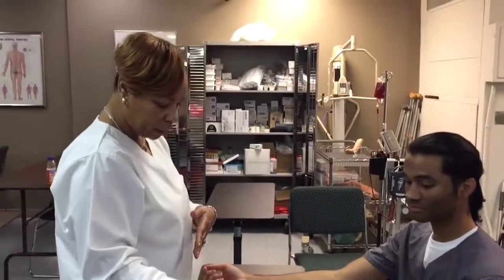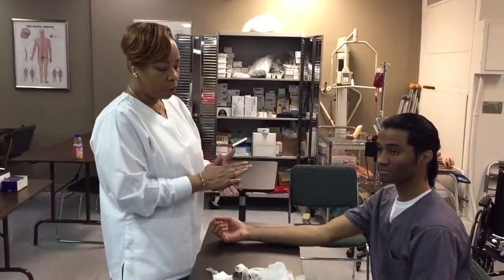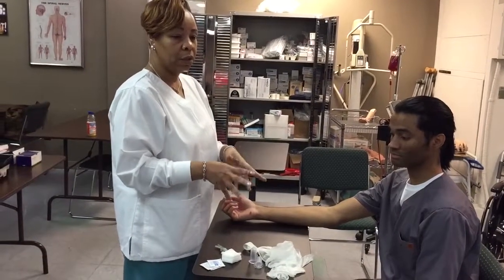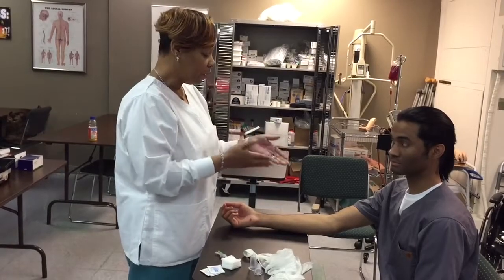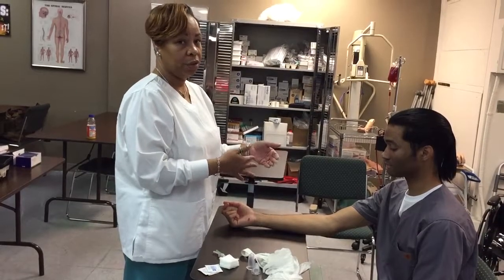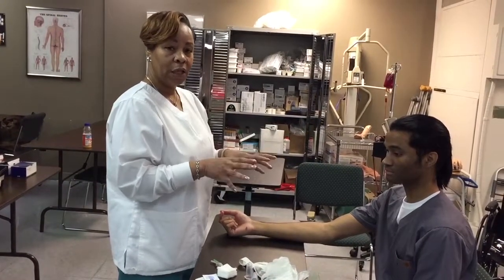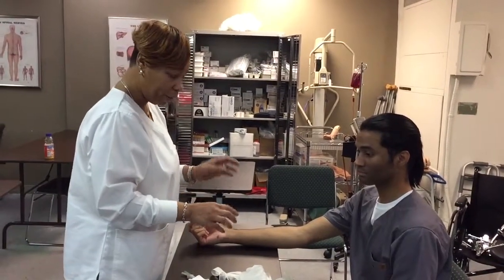The second thing you should do is make sure all your equipment is set up. I'm going to draw Mr. Stubbs, and I'm going to use a 21 gauge needle — this is my go-to, especially when I have prominent veins. You may need to put the tourniquet on first to see what gauge to use. Gauges come in 22s and 21s for straight needles, and the same for butterflies. We're going to do a straight needle draw.